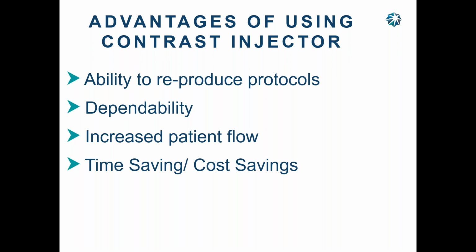When I was working at the Norfolk Hospital in Virginia, it was a 400-bed level 1 trauma, and they had 4 CTs going just for the ER all the time. And the patients were lined up down the hallway. They had 2 techs to position the patient, 1 tech to snap the syringes on, another tech to enter the protocols into the injector, and then another tech to enter the CT in. They were knocking them out in less than 10 minutes a patient, one right after another. It's built for speed. Those are the only injectors for CT built for speed with a lot of automatic stuff.